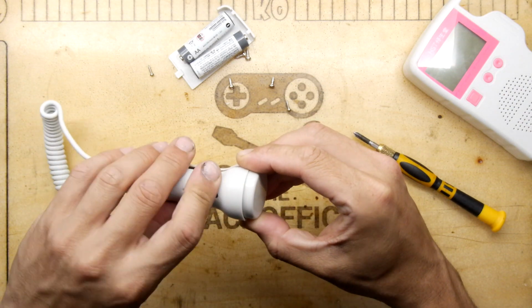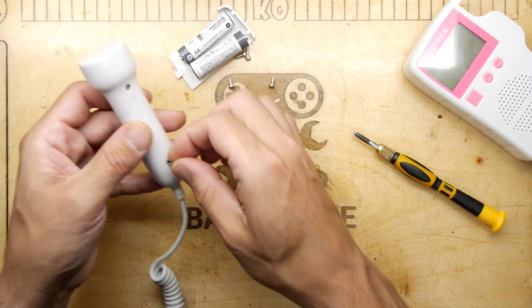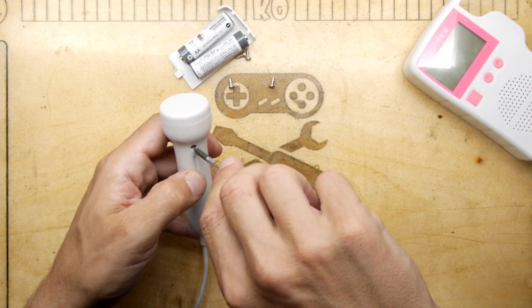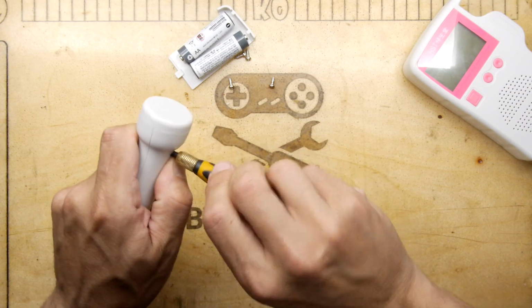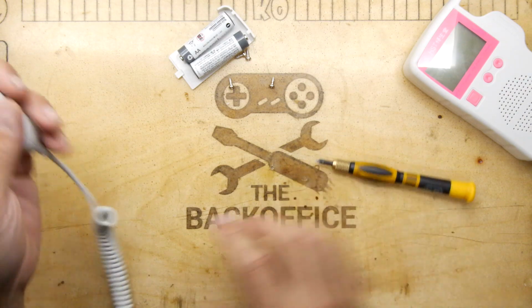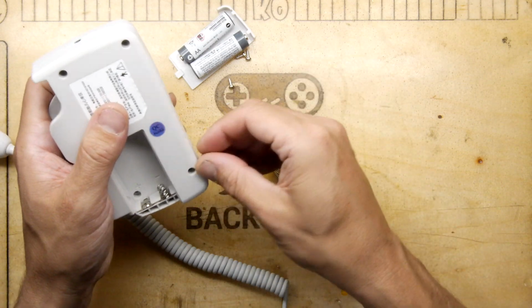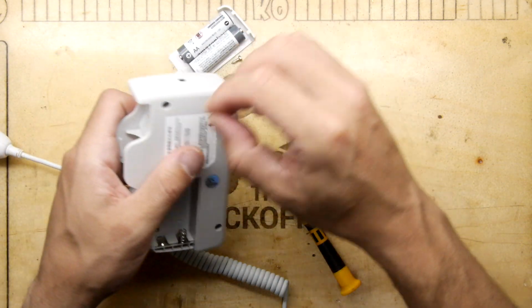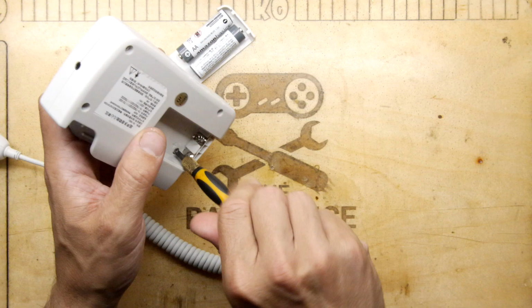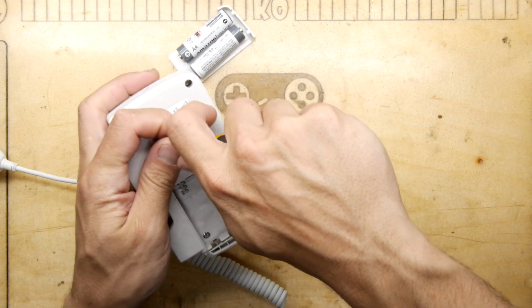Now doctors and the like in hospitals can probably use these to listen out for different things in your heart. So if you've got a heart murmur and all those things, they'll be using variations on this technology. It's just amazing that it's become so simple that it could be so mainstream now that you can just go to Argos and buy one of these. And to be honest, buy something of a reasonable quality. The plastics aren't too bad. I think I've seen these for maybe somewhere between the £20 to £40 price range, and at that you wouldn't really expect anything in terms of the plastics. I mean, it's obviously not the best, but it's absolutely adequate.